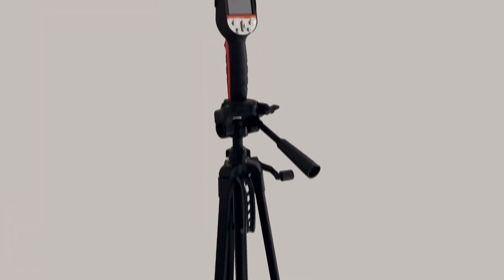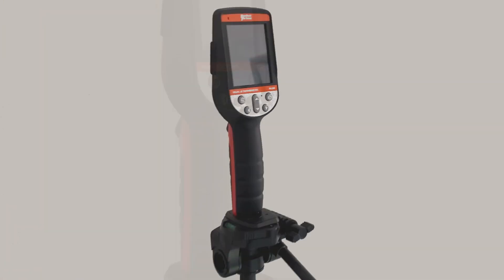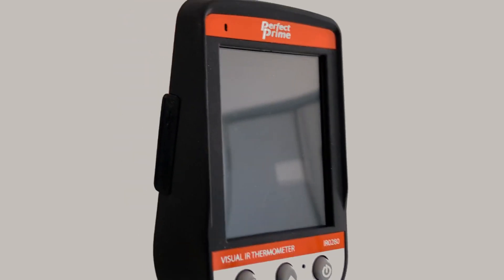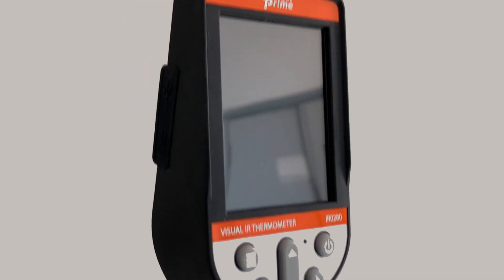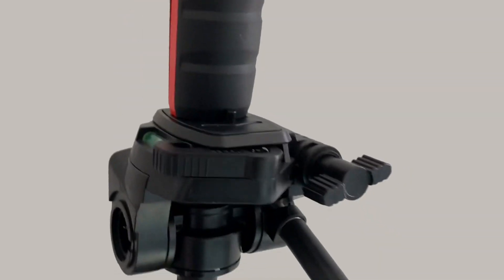Perfect Prime IR0280H is a thermal camera specially designed for human use. It can be used at a distance in order to allow the users to stay in a safe distance.